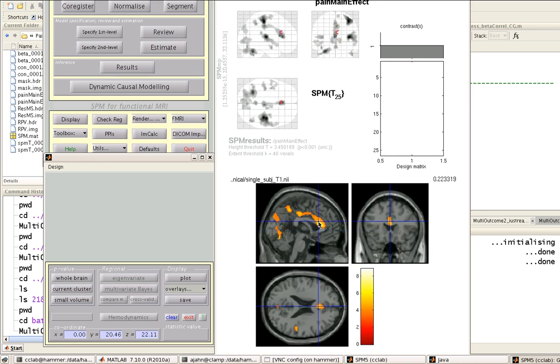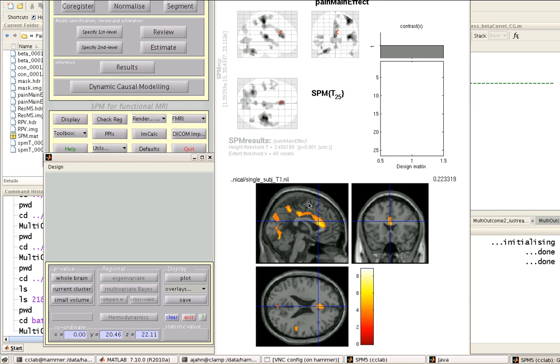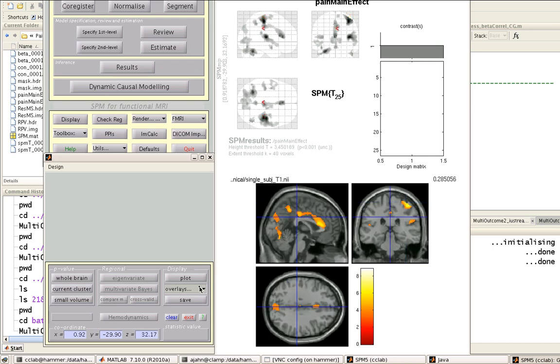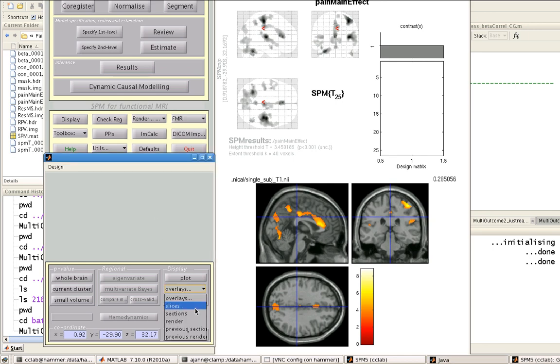Single Subject T1 is usually pretty good because you can see some of the underlying anatomy. So here we delivered shocks to the left hand. Not surprisingly, I see activation in the anterior cingulate cortex and the right motor cortex. Also know that if at any time when you load up different results, if you click on overlays and then click on previous sections after you've already loaded your sections, it'll bring back up this graph.